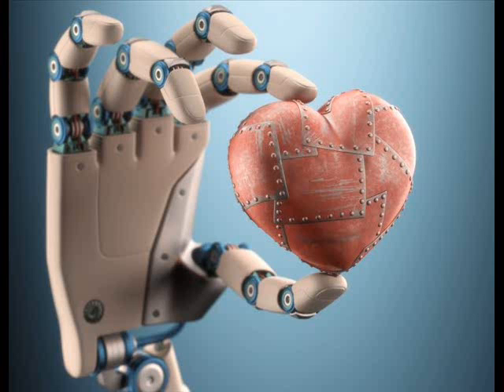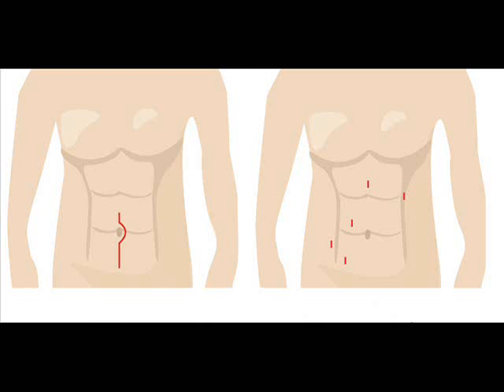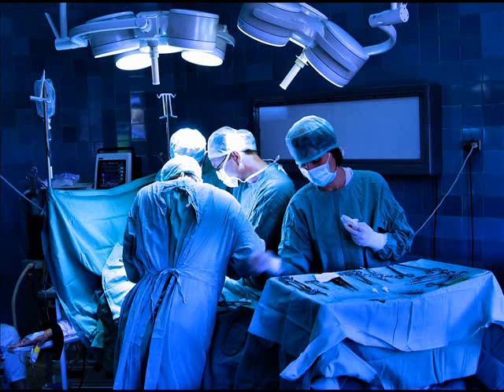Colon and rectal surgery. Many studies have been undertaken in order to examine the role of robotic procedures in the field of colorectal surgery. Results to date indicate that robotic-assisted colorectal procedures outcomes are no worse than the results in the now traditional laparoscopic colorectal operations. Robotic-assisted colorectal surgery appears to be safe as well. Most of the procedures have been performed for malignant colon and rectal lesions. However, surgeons are now moving into resections for diverticulitis and non-resective rectopexies. When evaluated for several variables, robotic-assisted procedures fare equally well when compared with laparoscopic, or open abdominal operations.